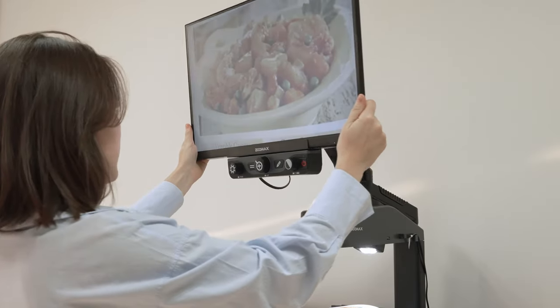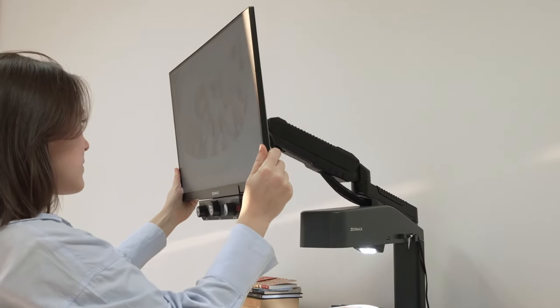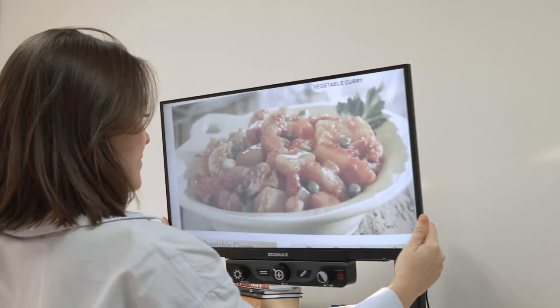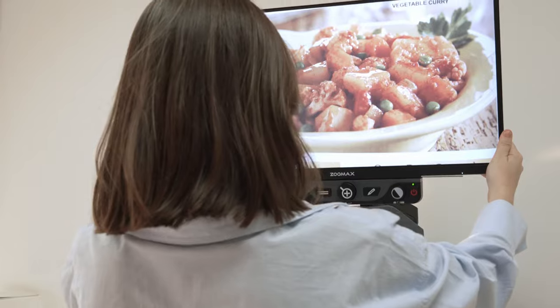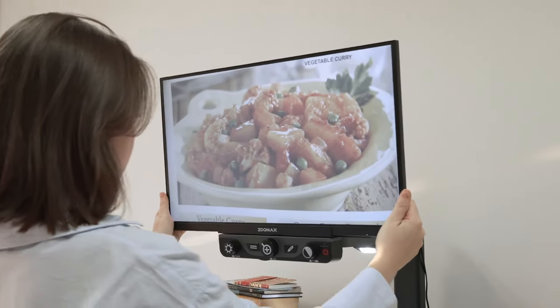The adjustable display and monitor bracket offers the most comfortable reading experience. Luna HD 24 Pro takes care of the user's specific needs at different operating levels.